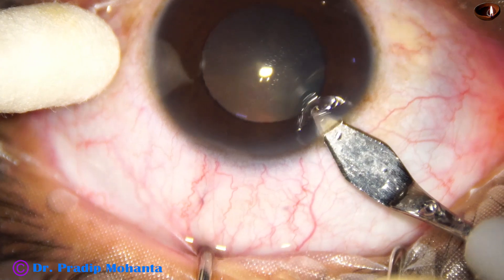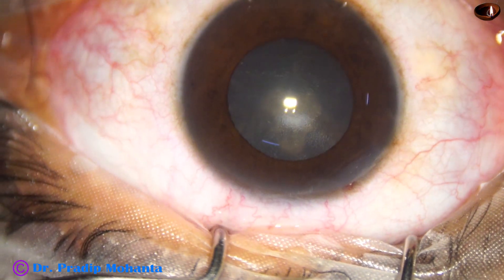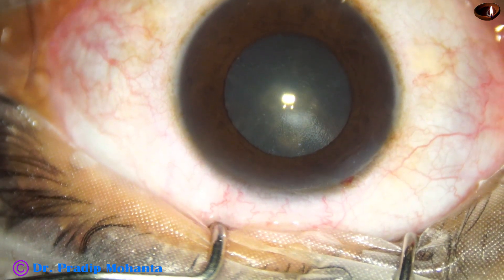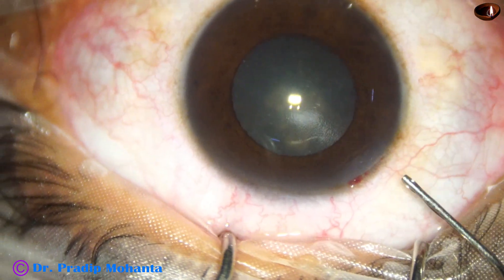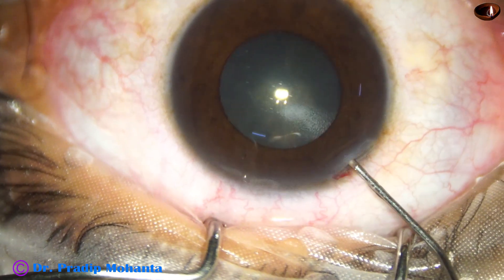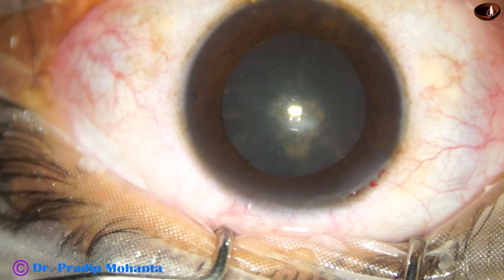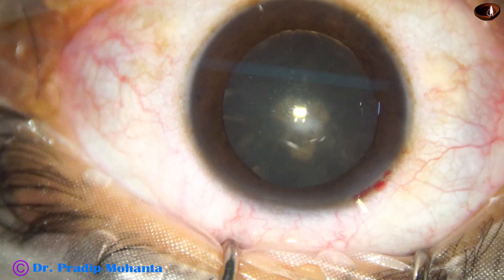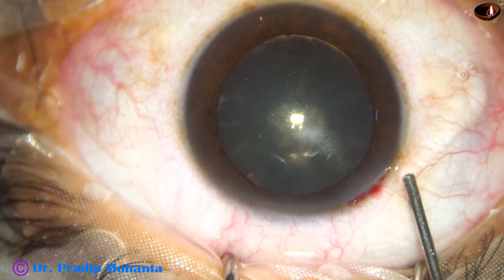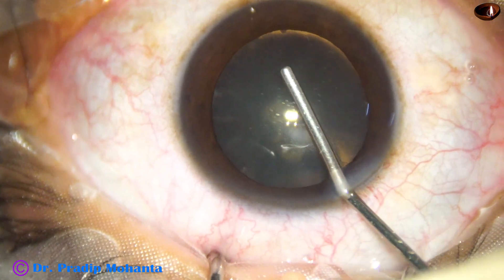It's a clear lens with only posterior subcapsular opacity, and the pupil is not dilated much. Let us apply phenocaine and see what happens. This is phenocaine, and within a few seconds the pupil dilates well. This is the magic of phenocaine, which contains tropicamide, phenylephrine, and lignocaine.